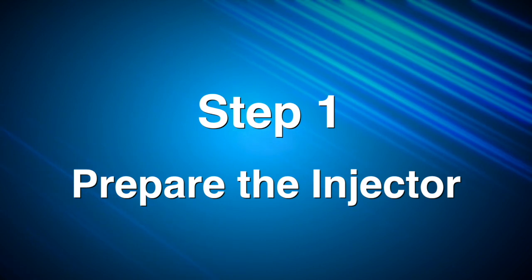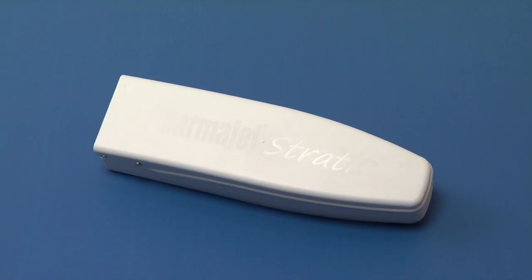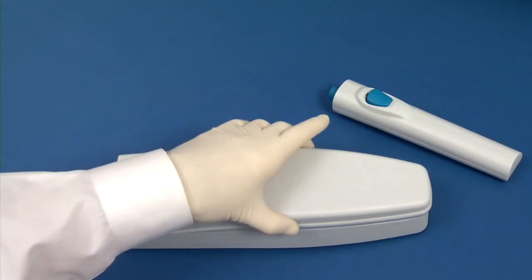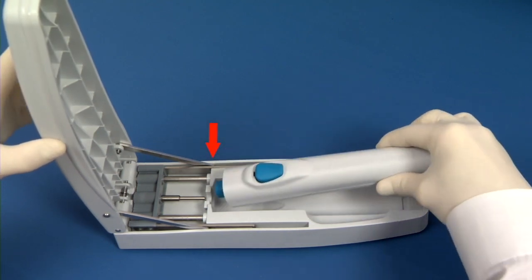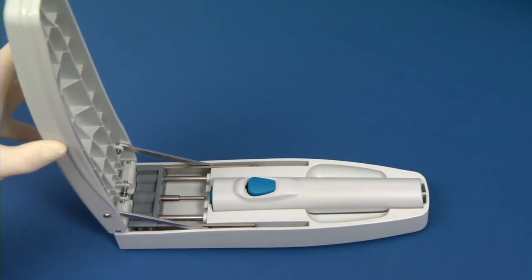The first step in using the PharmaJet Stratis injector is to prepare it for use. In this step, the reset station is used to charge the injector. Fully open the lid. With the PharmaJet logo facing up, insert the injector nose first, then lower the back half of the injector into the recessed area until fully seated.